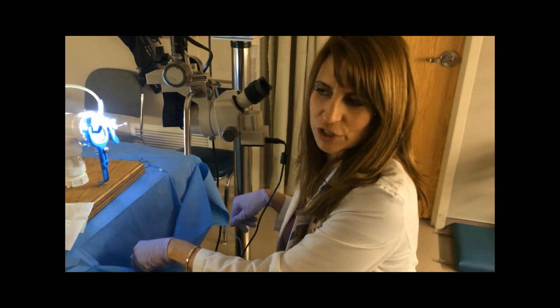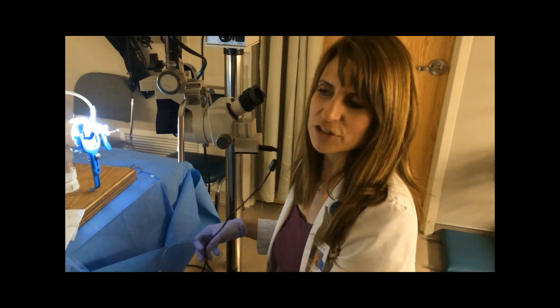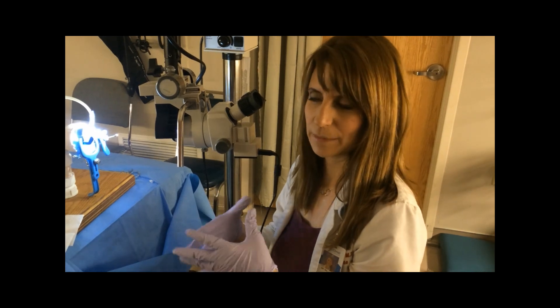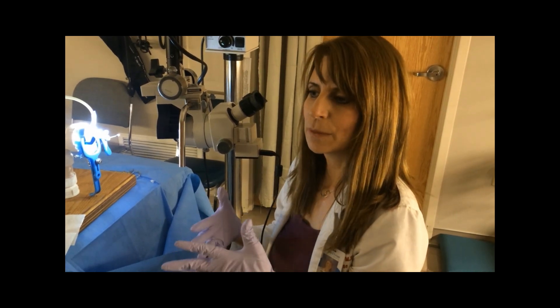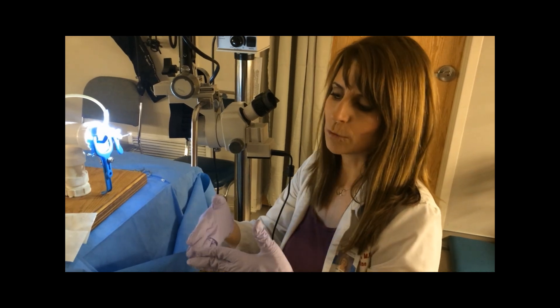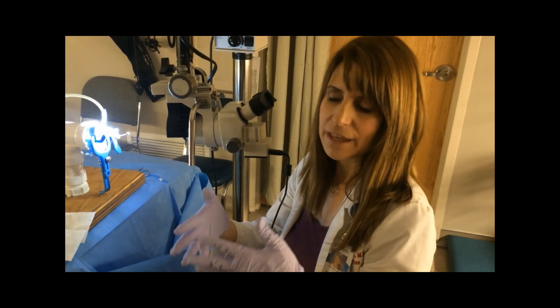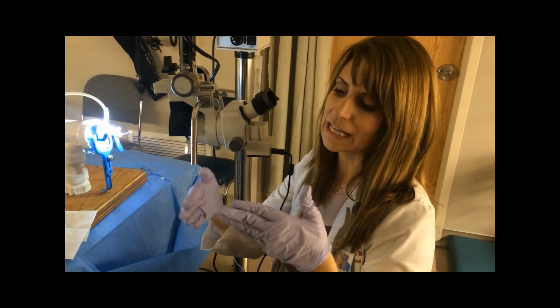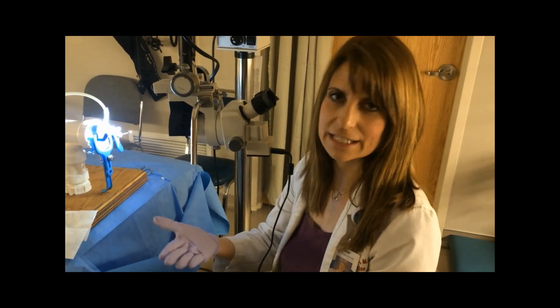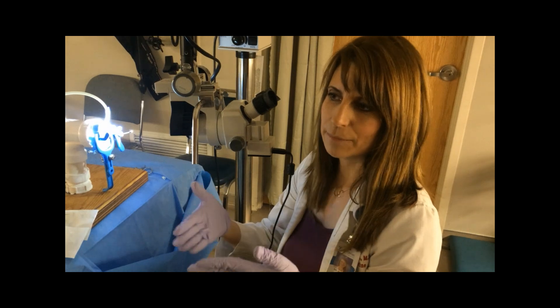One of the other things that I do is an endocervical curettage after a LEEP if they had a positive ECC or if there's any question that there could be some remaining disease. That gives me more insight when I get my pathology back if the abnormal cells extend to the margins. If the margins are involved but I have a negative ECC, then I'm much more reassured that I got what I needed to get with that LEEP procedure.